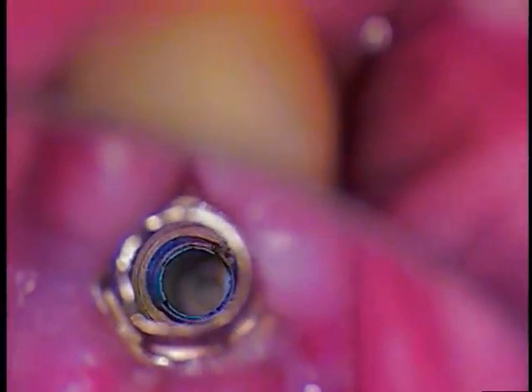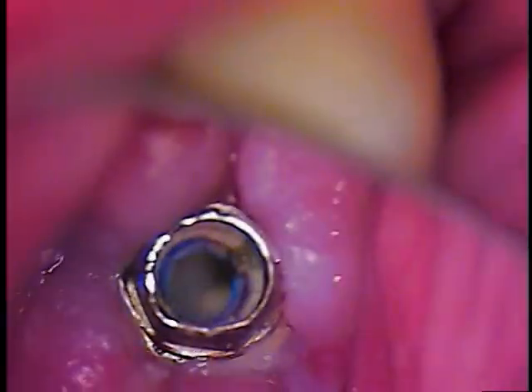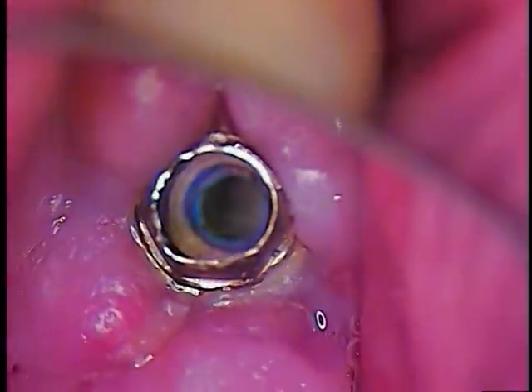Now I'm going to look at the upper component. It is blue — I repeat, blue color-coded. And there is a nick internally, just on the inside of this silver extension piece. I will take some photographs of that so we have them to show the rep.